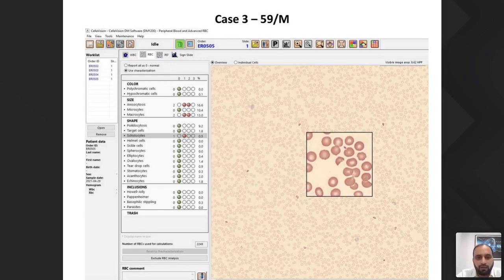Now, I am not sure whether I must report this or not, but as the recommendation goes, we need to look into the clinical context of the patient and also look into the other abnormalities.